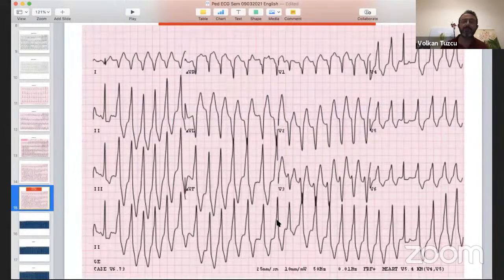You would expect more regular, more uniform looking. You wouldn't expect this narrow bit in between, but again, it's not 100%. You cannot say for sure.